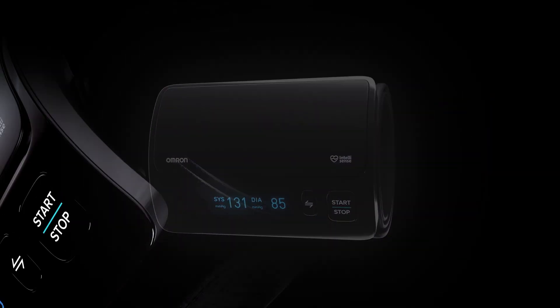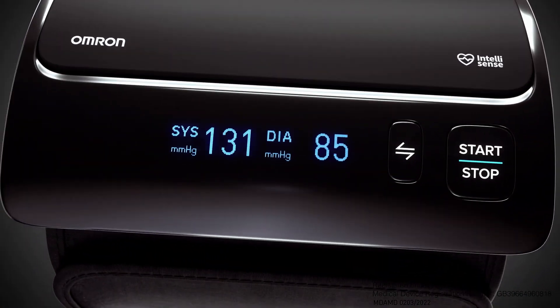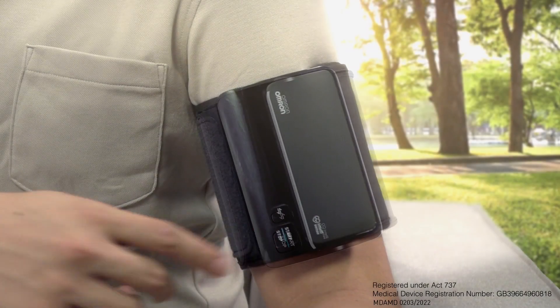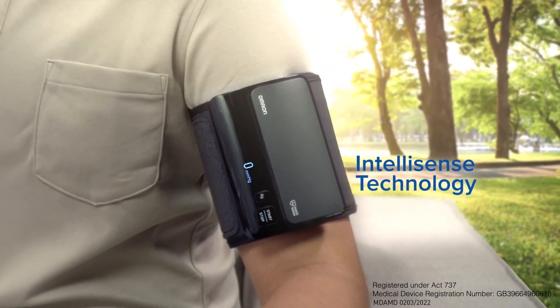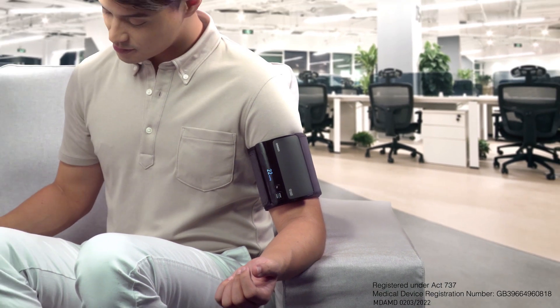Introducing the new Smart Delete Plus Blood Pressure Monitor with the Intelli-Wrapped Cuff that snaps easily anywhere on the upper arm to give accurate readings. Track your heart health with just one touch. Its IntelliSense technology provides comfortable readings with every use.